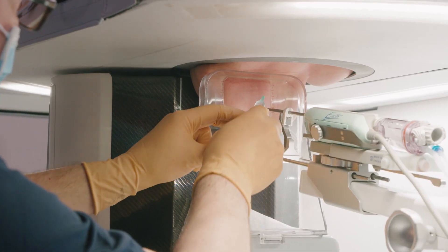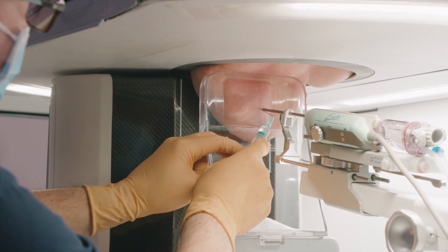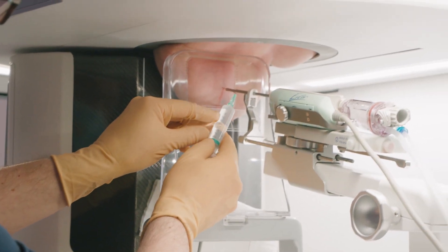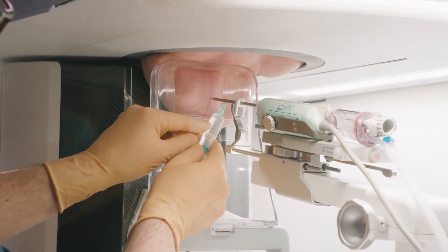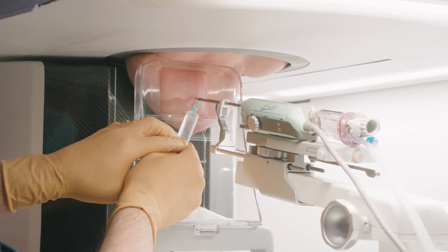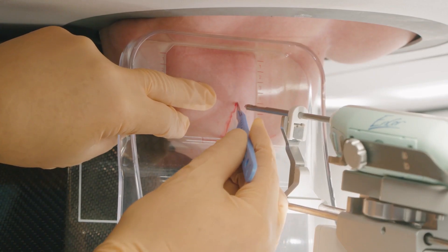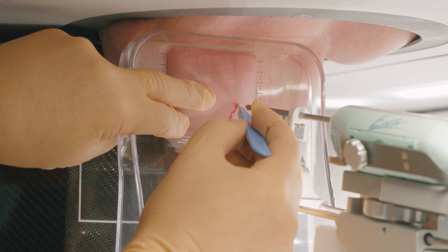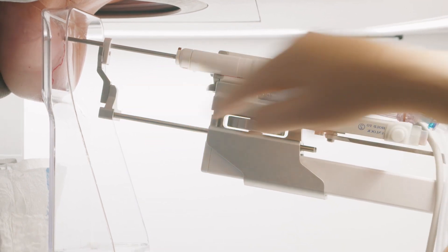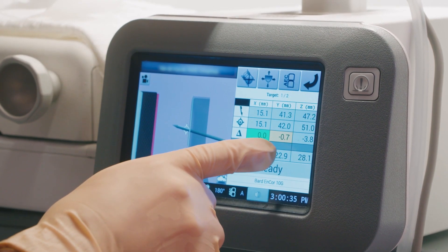First, we anesthetize the skin with 5cc lidocaine 1%. For deeper anesthetic, we inject 5cc lidocaine with adrenaline 1%. Adrenaline causes vasoconstriction and diminishes the risk of local bleeding. I make a small cross incision in the skin. Through this incision, the needle is advanced into the breast until it reaches the desired position as indicated by the green indications on the screen.